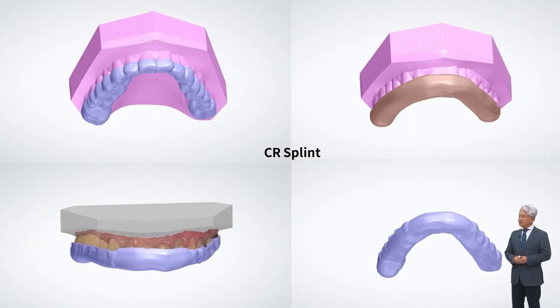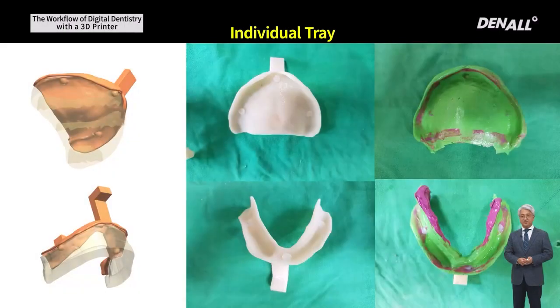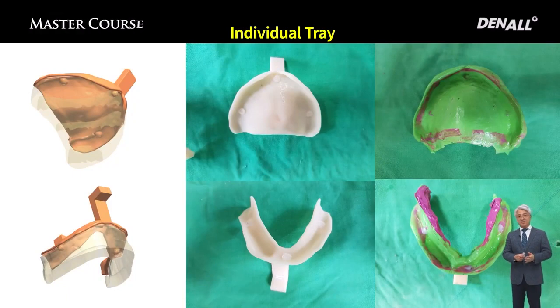On CAD, the 3D printing design is prepared. As you can see, recording base, individual tray. These can be designed very quickly.